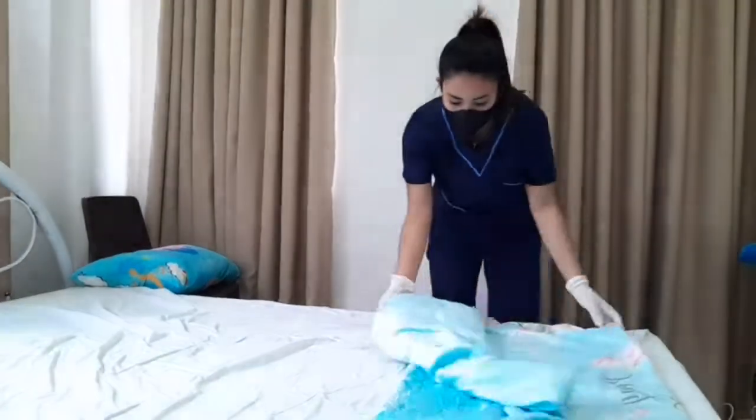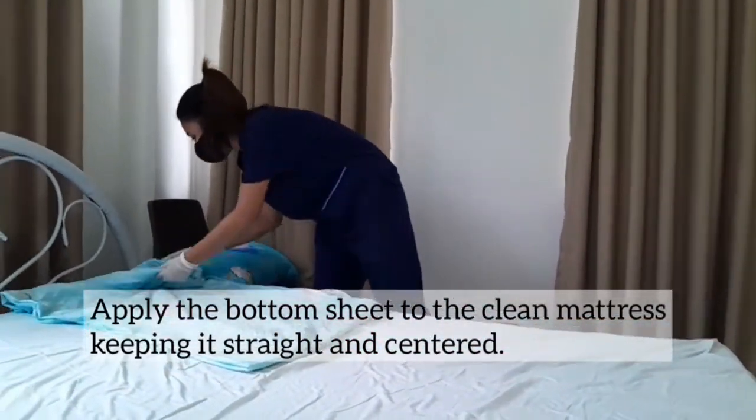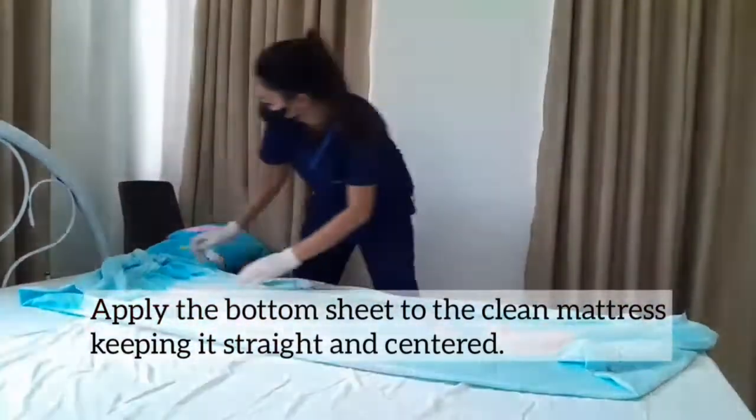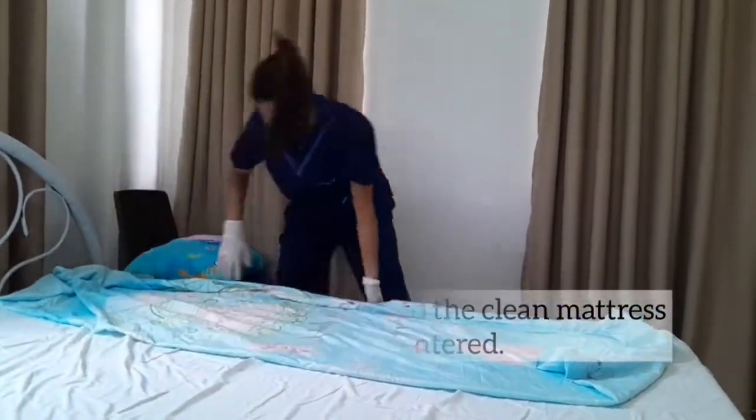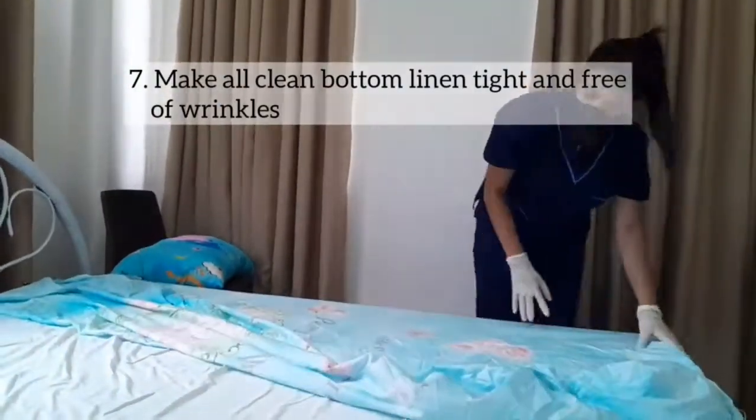Step 6: Apply the bottom sheet to the clean mattress, keeping it straight and centered. Step 7: Make all clean bottom linen tight and free of wrinkles.